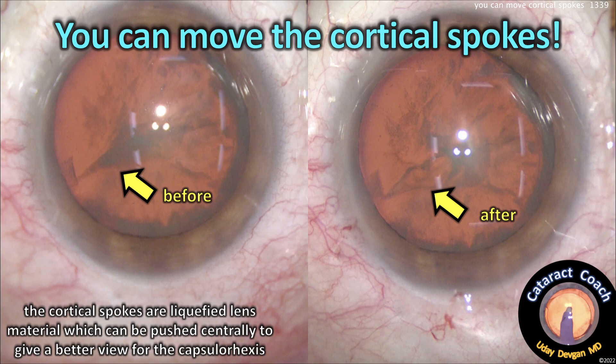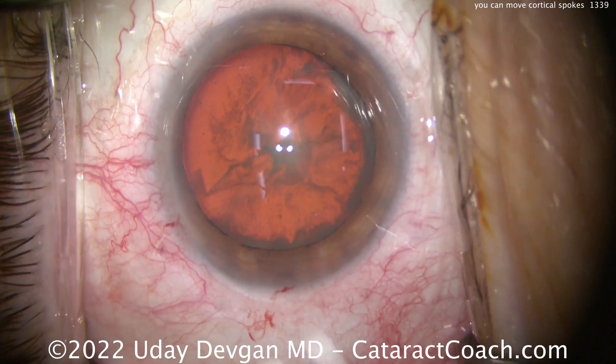So now look at the before and after — it really did work. So yes, you can actually move these cortical spokes out of the path of your rexis.